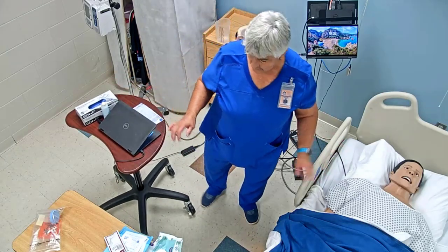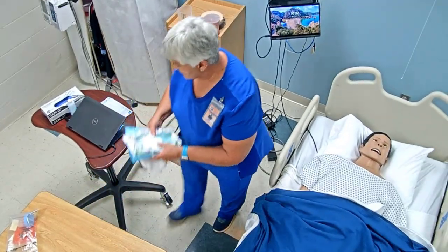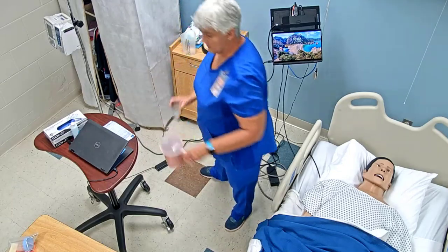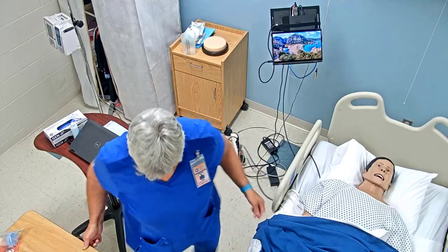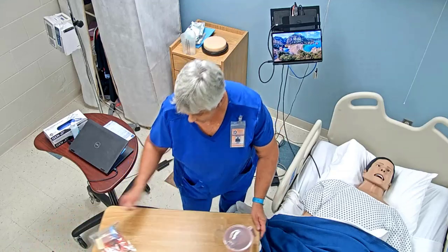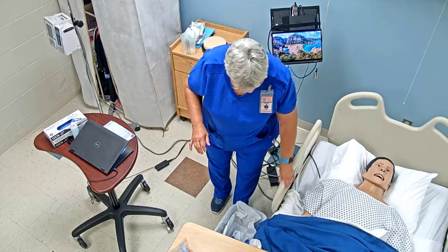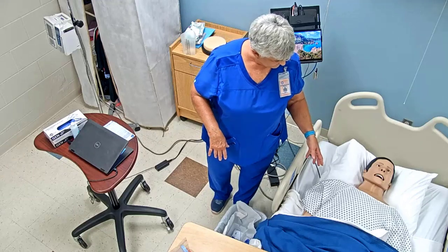Make sure our patient's in a good, comfortable position. We're going to go ahead and make sure we have all of our supplies. We'll leave those in the patient's room. I've got a new cup and bill so we can have it for our patient. I'll move my trash bag, get my table where the patient can get it. Okay, so bed low position, side rails up times two, wheels are locked, call light within reach. Is there anything else that you need?